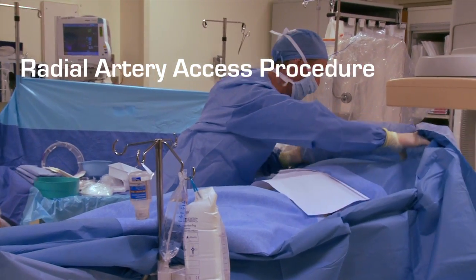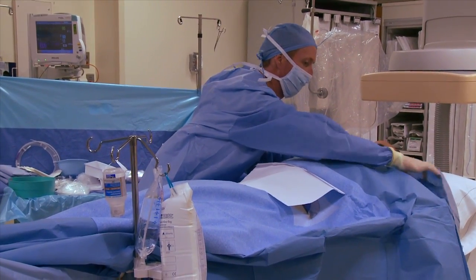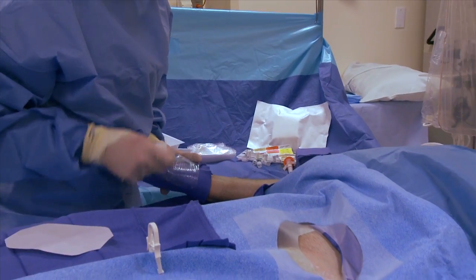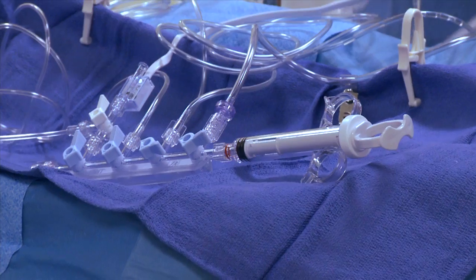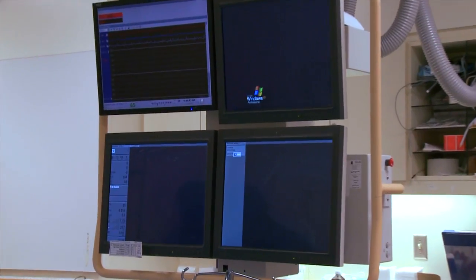You will be brought into the catheterization laboratory where the technician will place sterile drapes on you. He will then wash your arm with clear, cold cleaning solution and apply the sterile drapes in the area that we will be using. You will be hooked up to pressure monitoring and EKG monitoring so we can watch your heart rate and blood pressure.